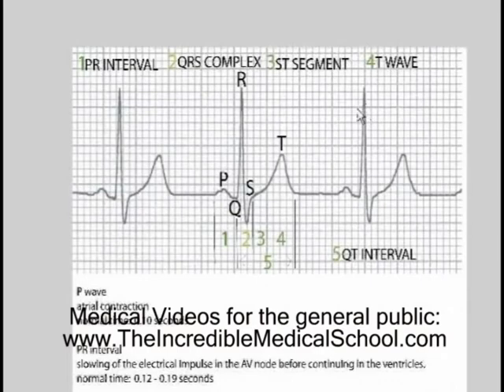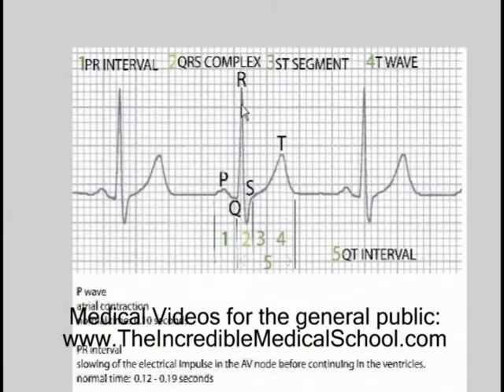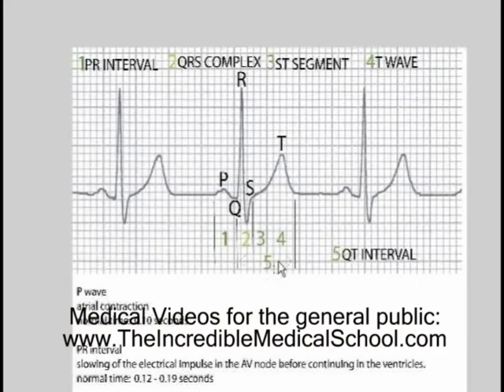In this example, we have 19 small boxes for the RR interval. Therefore, the QT interval should be less than half of that. Measuring the QT interval, we get approximately 8 boxes, which is less than half — so the QT interval here is correct.